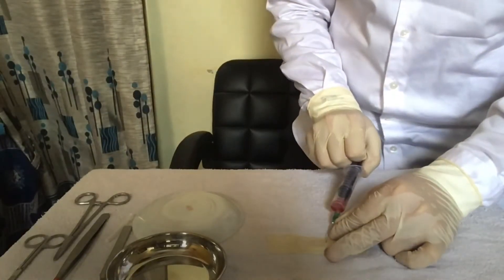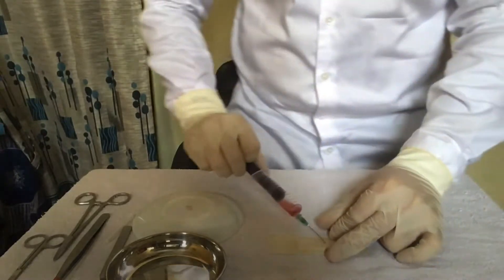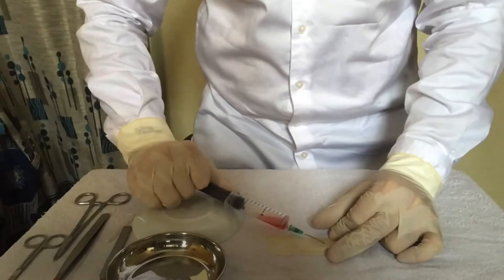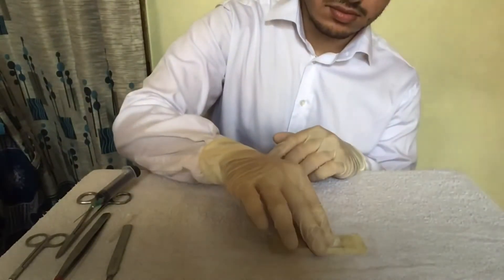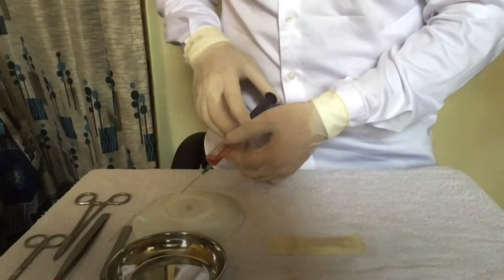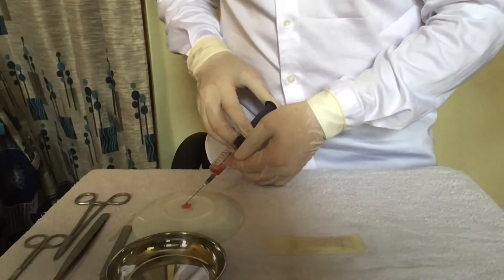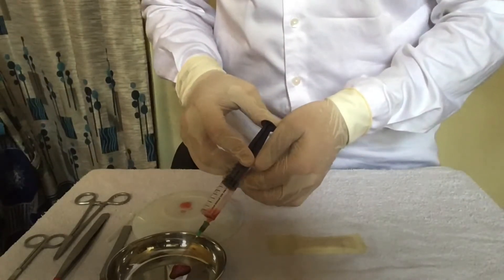As soon as you remove the syringe, press the site of collection firmly with the help of cotton or bandage. Now put the required amount of sample on a glass slide and pump out the rest of the collection into a container.